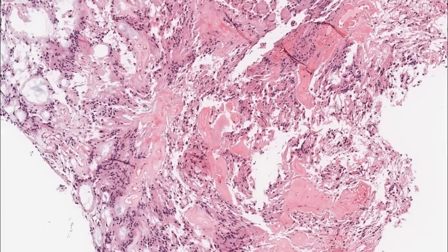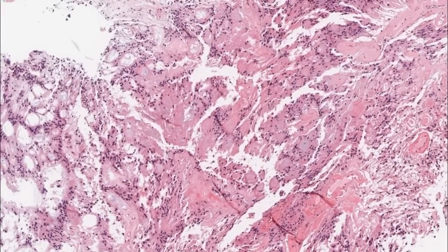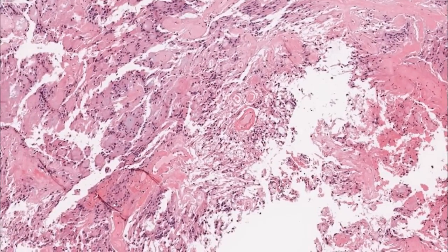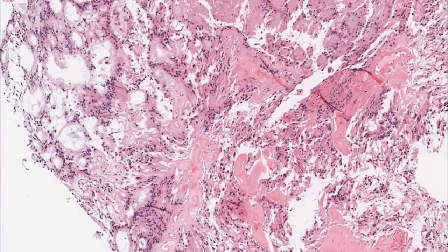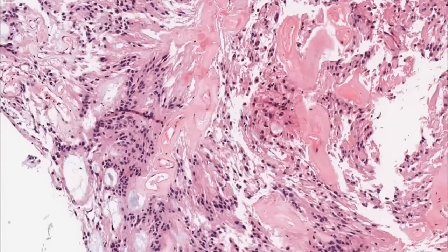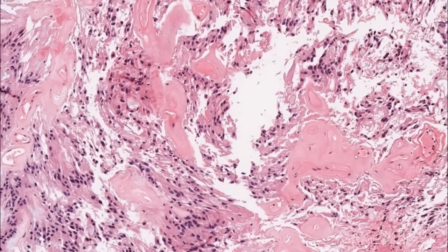And you can again start seeing cell processes ending up in these vessels, similar to the tumors that we were seeing. These are pseudorosettes. What is different here is that the vessel walls have a lot of hyalinization. And also you start seeing all this myxoid stroma. Some of that is making microcysts. Some of it is actually in the vessel walls, surrounding the vessel walls, in between these tumor cell processes. This is highly characteristic for this tumor.